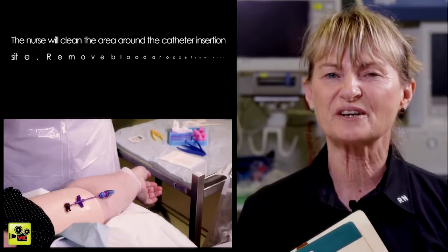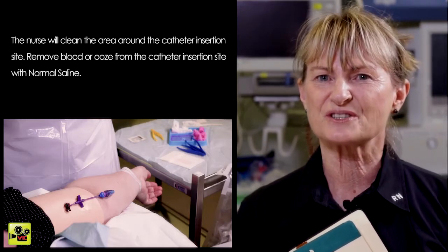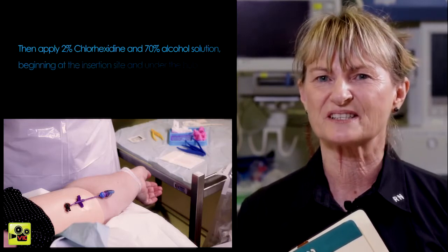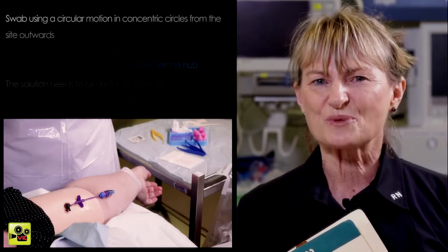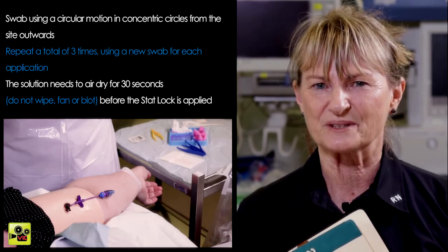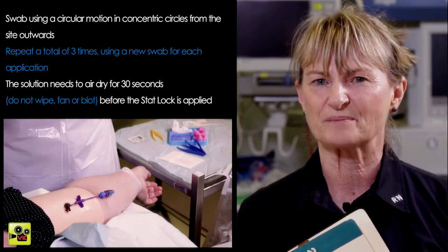The nurse will clean the area around the catheter site, remove blood or ooze from the catheter insertion site with normal saline, then apply 2% chlorhexidine and 70% alcohol solution, beginning at the insertion site and under the hub. Swab using a circular motion in concentric circles from the site outwards. Repeat a total of 3 times, using a new swab for each application.